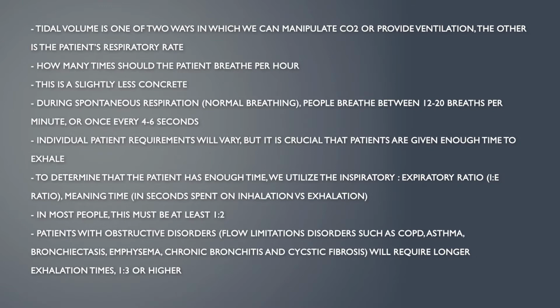Now, it's important that we give the patient enough breaths to allow for ventilation and for oxygenation. But we do need to remember that the entire ventilation component is contingent upon the patient being able to exhale. And if the patient doesn't have enough time to exhale, then the entire process is not going to work.